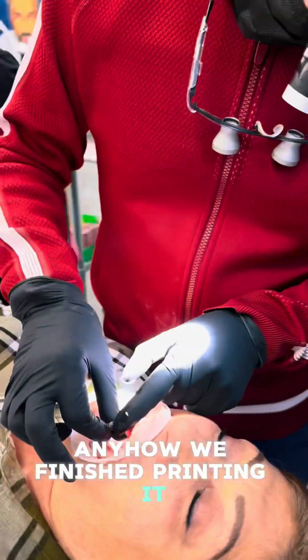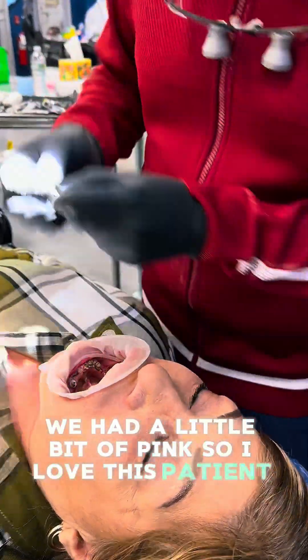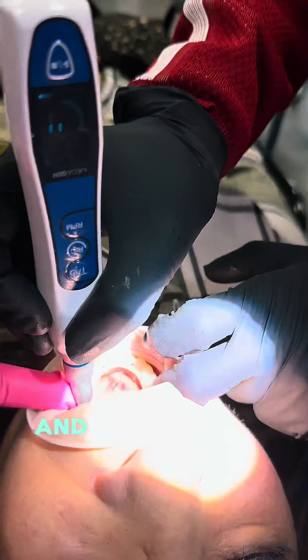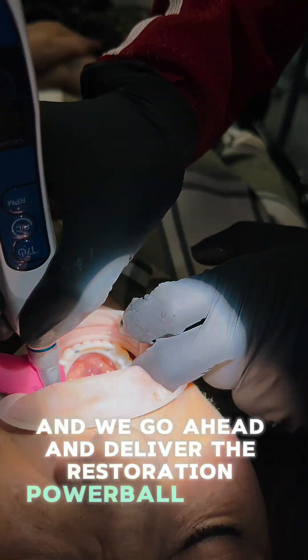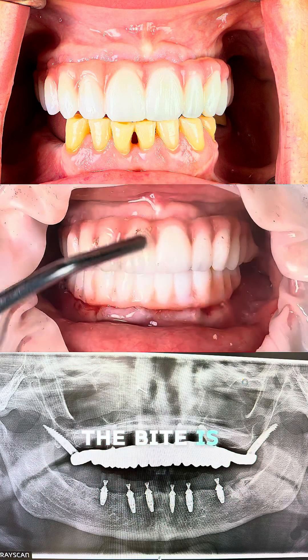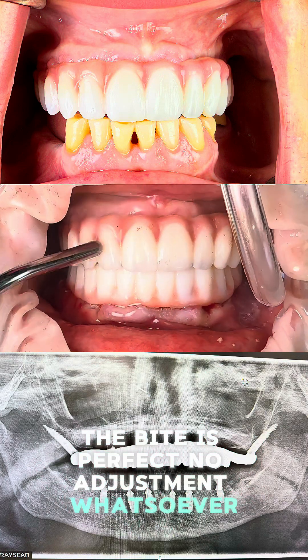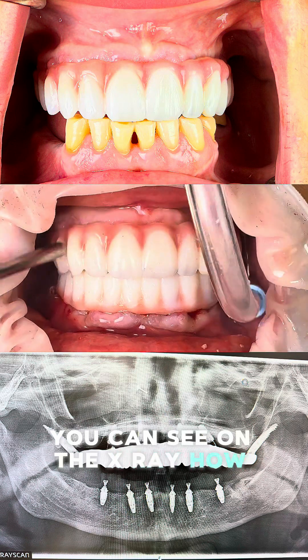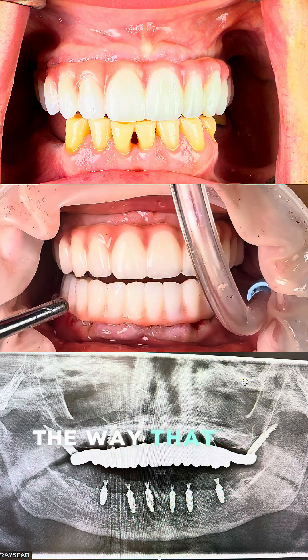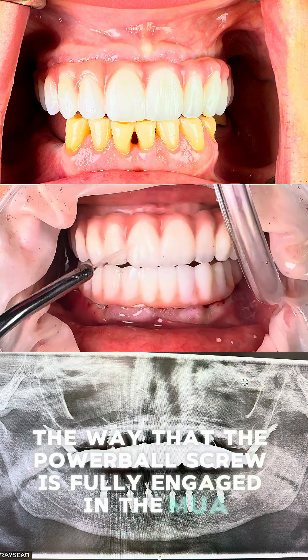We finished printing, added a little bit of pink because I love this patient - she's a sweetheart who's been my patient for a while. We delivered the restoration with the Powerball screw at 10, 15, then 20 Newton-centimeters of torque, and the bite is perfect with no adjustment whatsoever. You can see on the x-ray how everything is fully seated and the Powerball screw is fully engaged in the MUA.